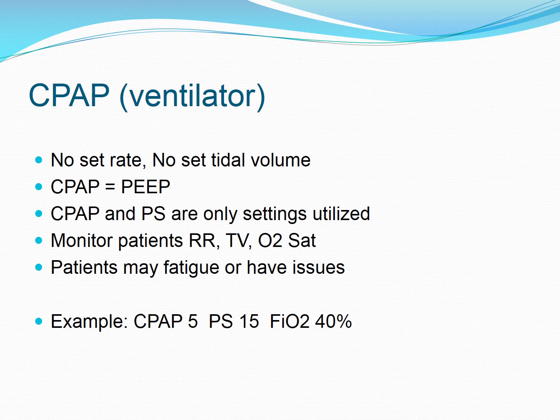Many of the patients that are on ventilators do have some form of sedation. So we take them off sedation for about an hour or so so that the patient is alert and awake, because remember, to be on CPAP, the patient has to be able to breathe spontaneously. So this is also sometimes referred to as a spontaneous breathing trial.